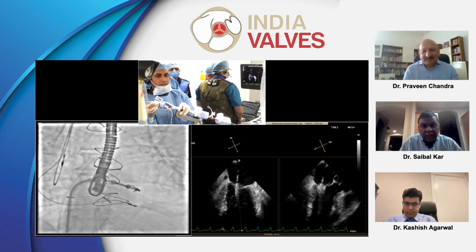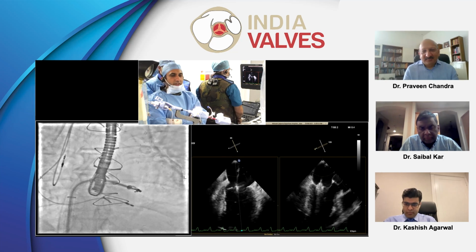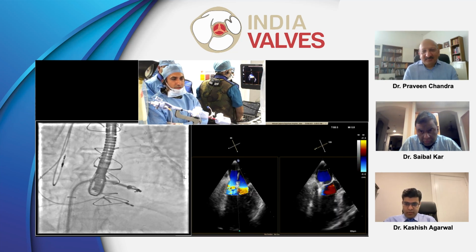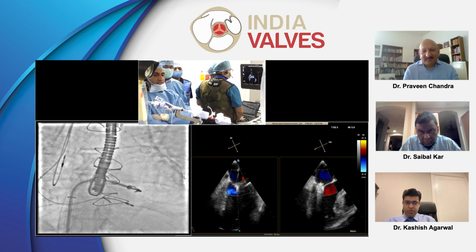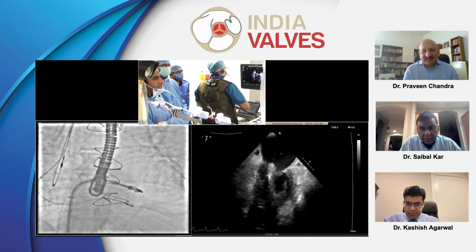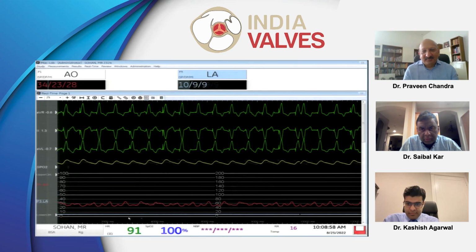Okay. What is the LA pressure like? Can I see? Yeah, can you see the tracings now, LA? We'll look at the MR. Yeah, there's no MR. Are you closed all the way? No. Can you focus on the hemodynamics? Just focus on the hemodynamics screen, please. Yes, look at the LA pressure. We will come down.